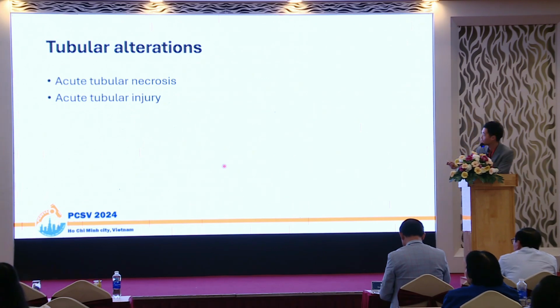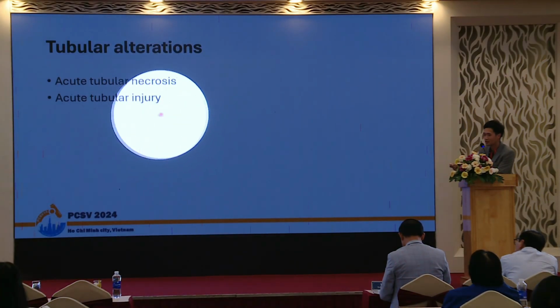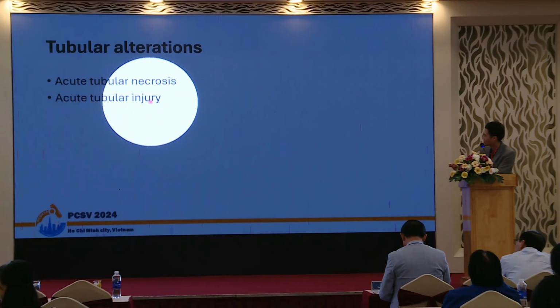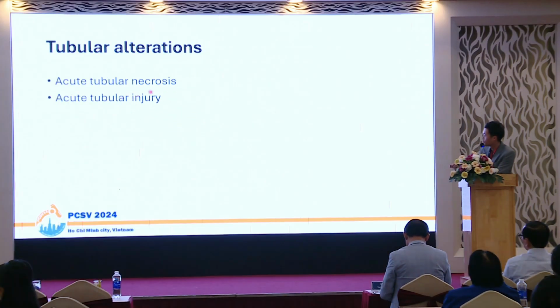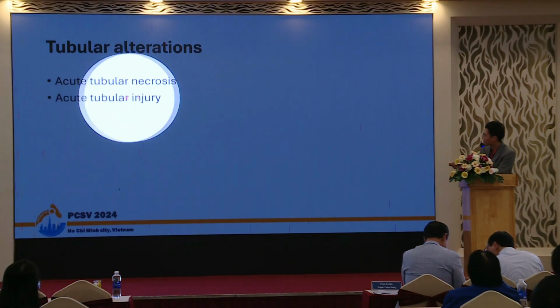Let's move on to the tubular pattern. Tubules can show necrosis, but nowadays I think many people prefer to use just injury, because not all injury shows necrosis.